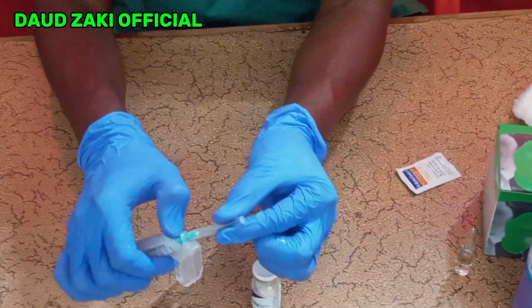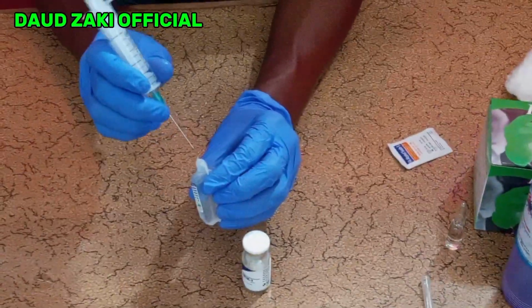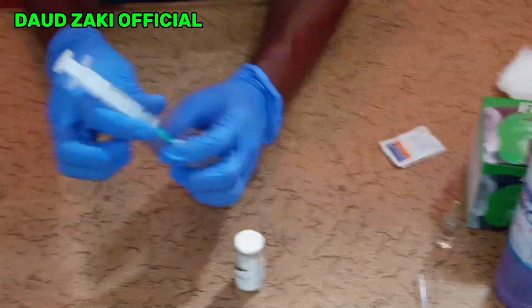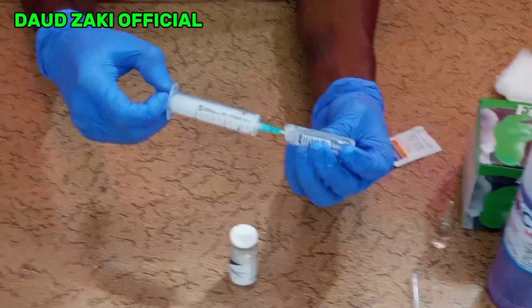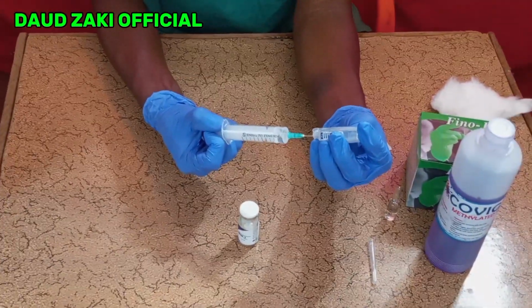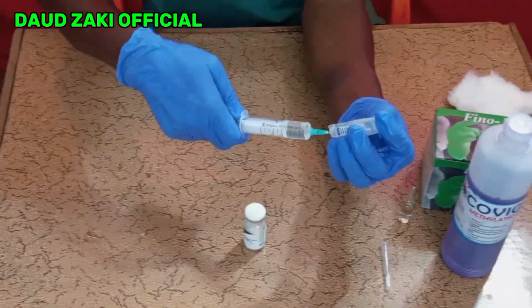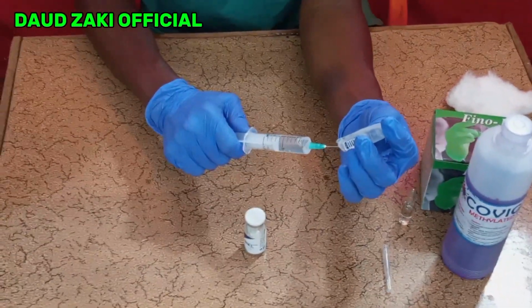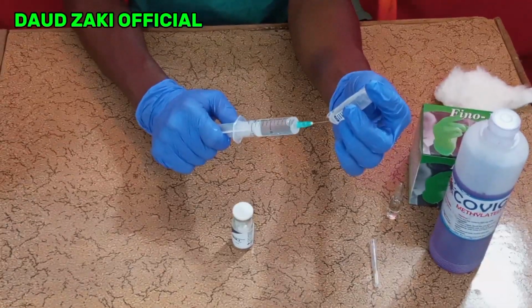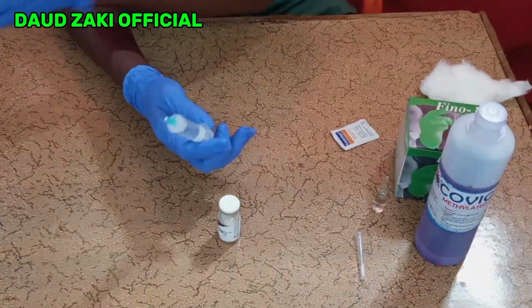You remove the needle cap, then you insert the needle into the plastic vial containing the sterile water for injection. You hold it upside down horizontally, then you pull back the plunger to withdraw all the sterile water for injection to reconstitute with the white powder of the drug. This is how you withdraw the sterile water for injection.